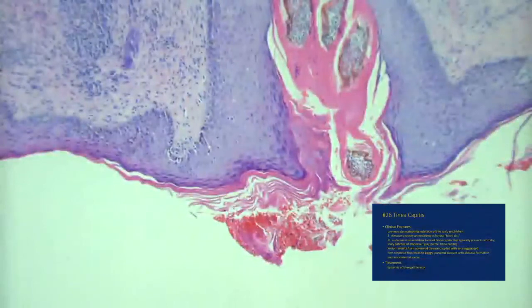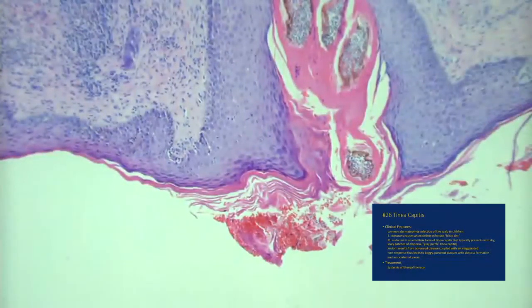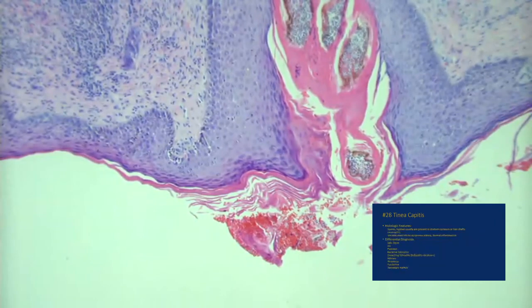Now, we sometimes see microsporum, but it's pretty rare today. The vast majority of these are from trichophyton. So, a good example of that. You'll never forget that as long as you live.